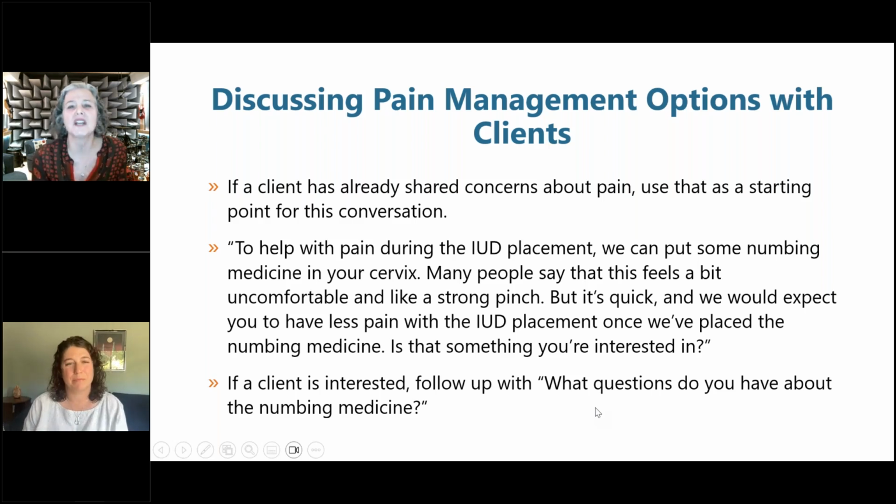We like to give some sort of an early script, something like, to help with the pain during the placement of the IUD, we can put some numbing medicine in your cervix. And many people say this feels a bit uncomfortable and like a strong pinch, but it is quick, and we would expect you to have less pain with the placement once we've placed the numbing medicine. Is that something you're interested in? This is just language that we've tried, and we suggest your language needs to be something that you're super comfortable with coming out of your mouth. But think about that each of the words be not over a 4th, 5th grade reading level, so words everybody would know the meaning of, and again, that are not too scary.